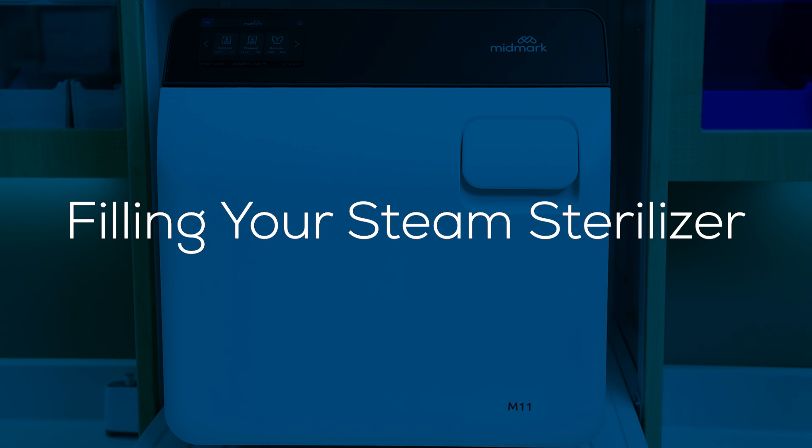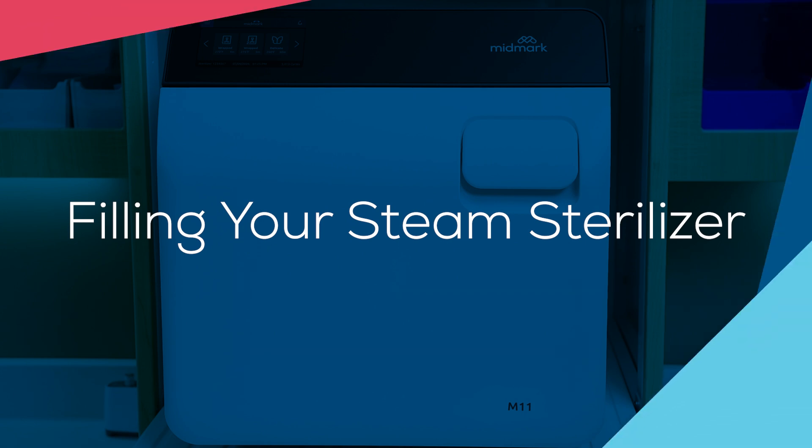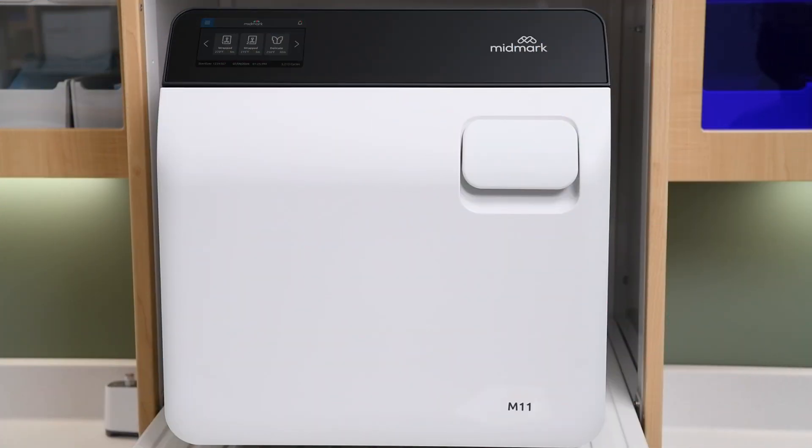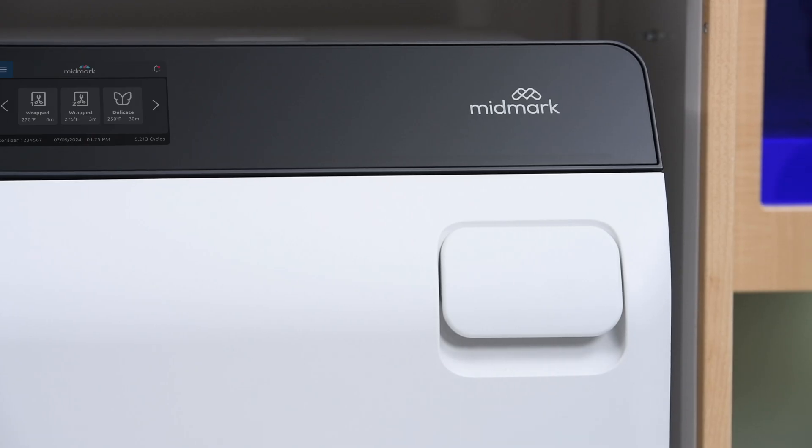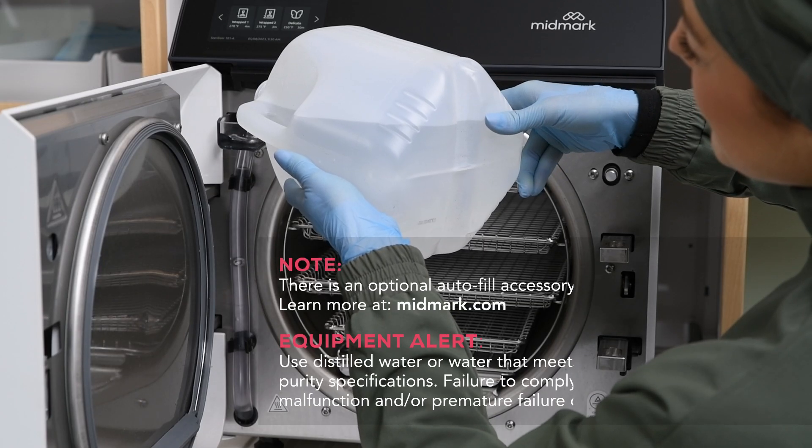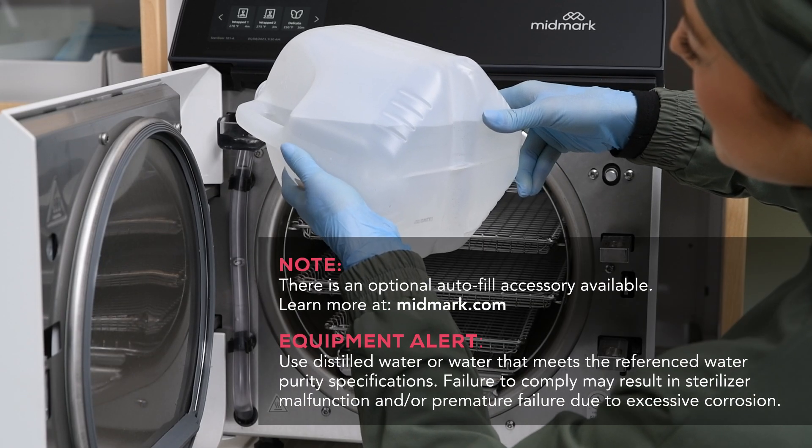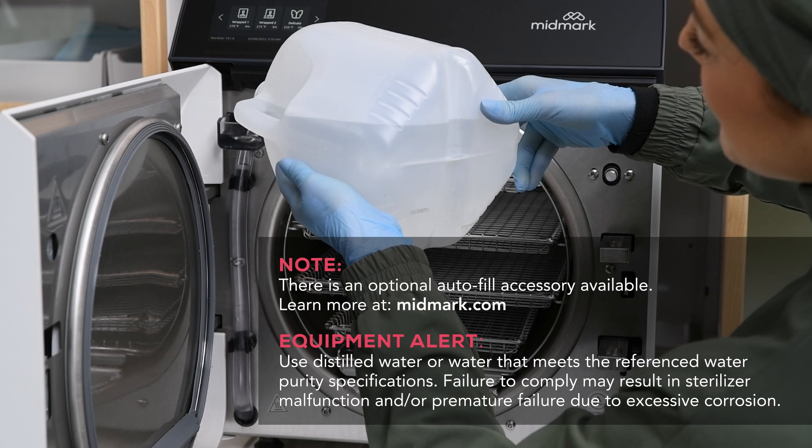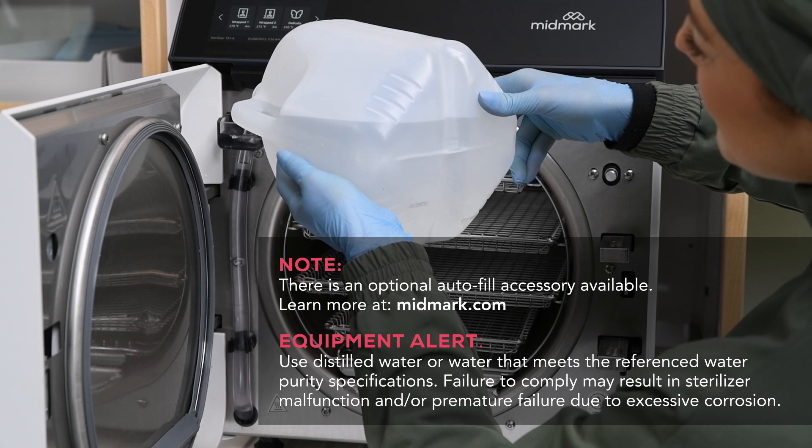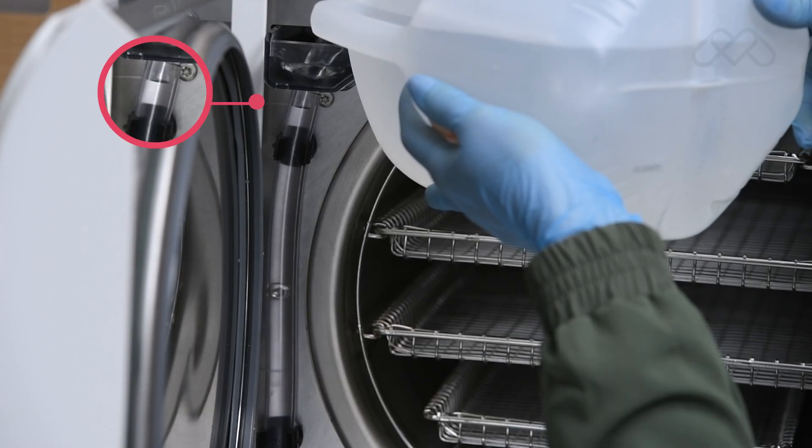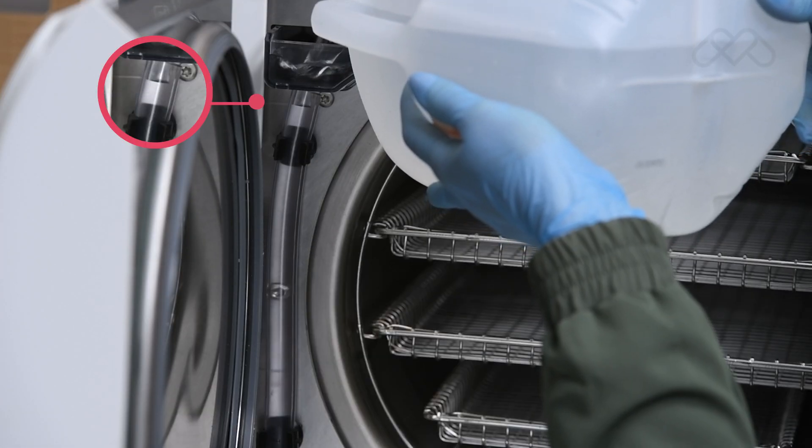Filling your steam sterilizer. To fill your steam sterilizer, open the door to the sterilizer. Pour distilled water into the fill opening until the water level reaches the top of the fill level label on the water level indicator tube.